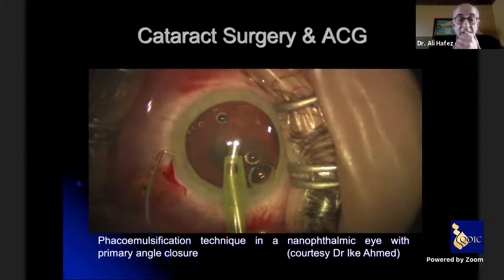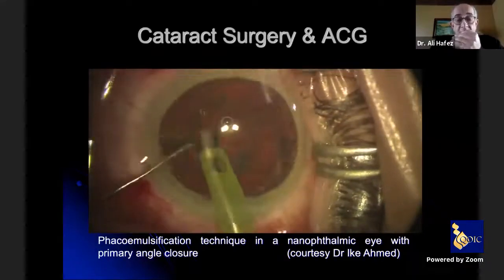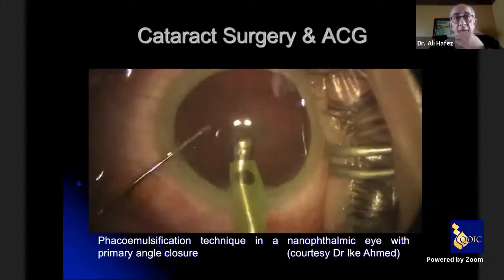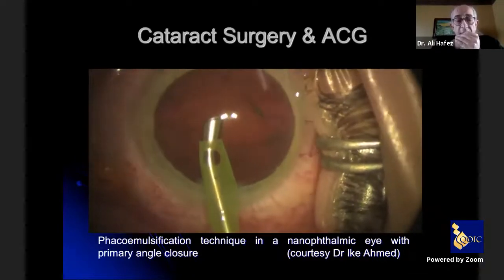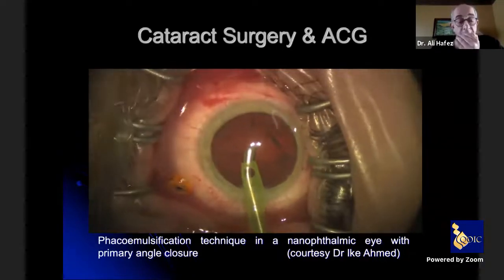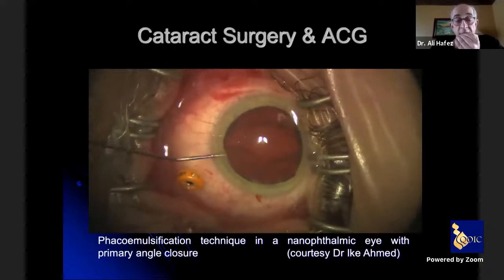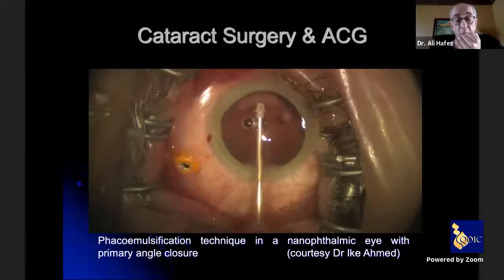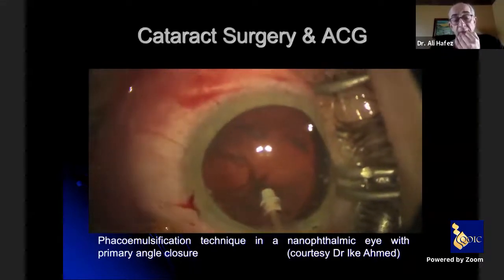There is no real vitrectomy at that point. This is a regular cataract surgery, and vitrectomy comes in at a later phase of the procedure after removal of the lens. Now, this is maybe the most important point in the surgery. Whenever an instrument is removed from the eye, care should be taken not to lose the anterior chamber.